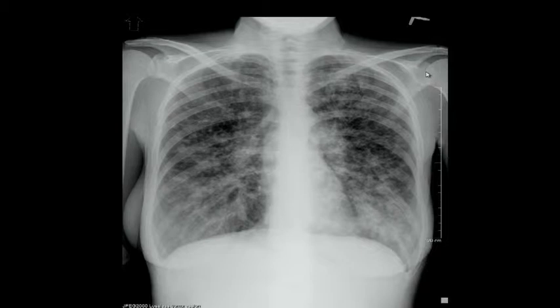Okay, so I would say that there are multiple different opacities of different sizes. Some of them are larger, some of them are very small, throughout bilateral lung fields diffusely. Then we could say that this is possibly a nodular pattern or reticular nodular. If it's not miliary, it's diffuse bilateral lung field opacities. So this is how I would say it, and correct me if I'm wrong.